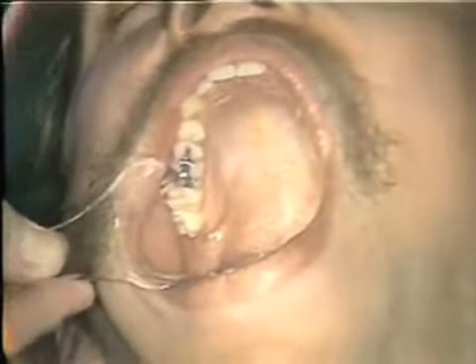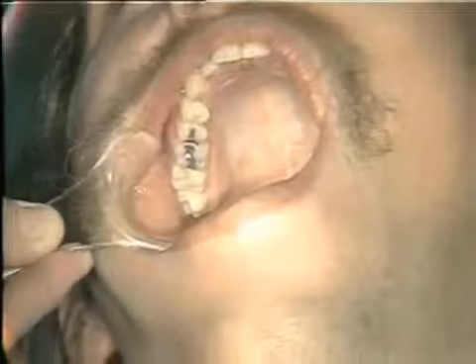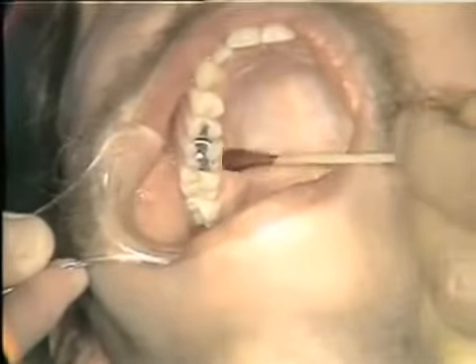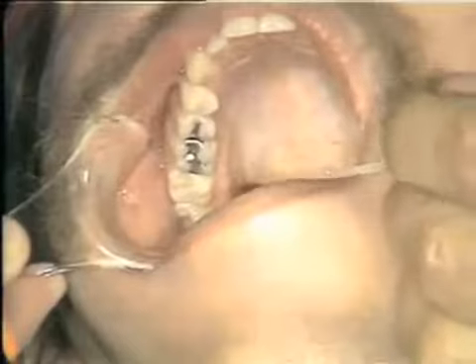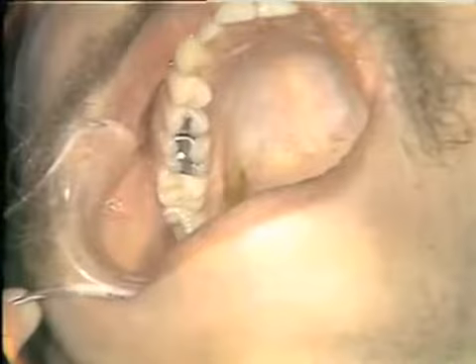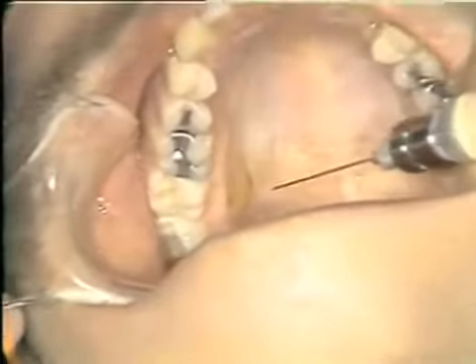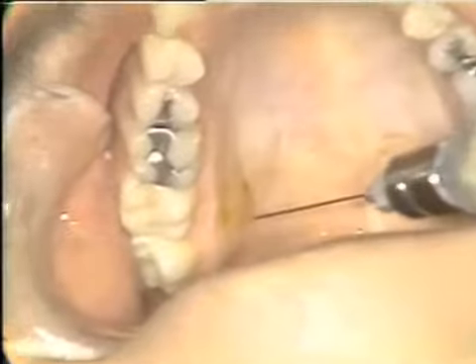All right, let us show you the anterior palatine injection on Mr. Fry. And if you'll open real wide for us. Oh, that's great. Now we'll dry the mucosa here first in the usual fashion. Just resting it there for a few moments, and then we'll apply a little betadine in our injection site. And now we'll make the approach with our syringe. Now you can see I'm at about the level of the third molar.